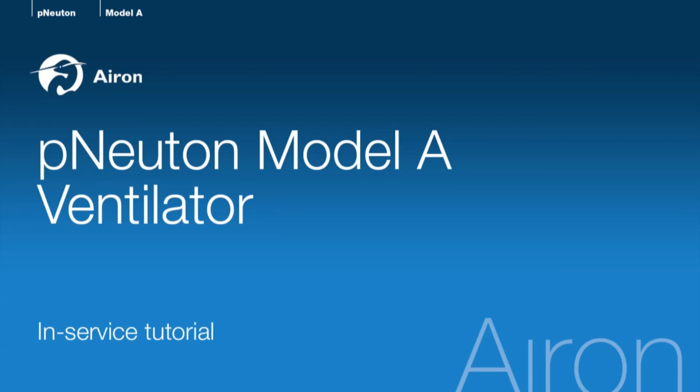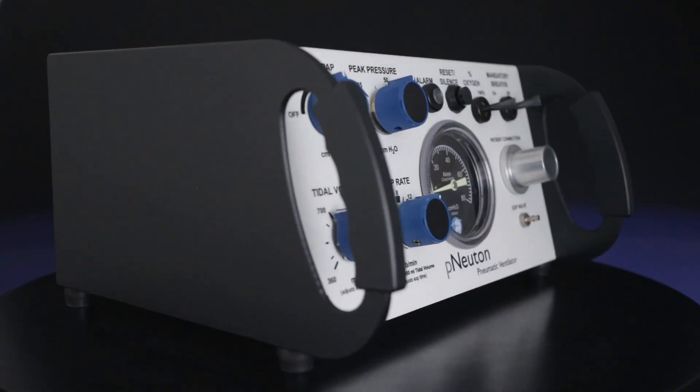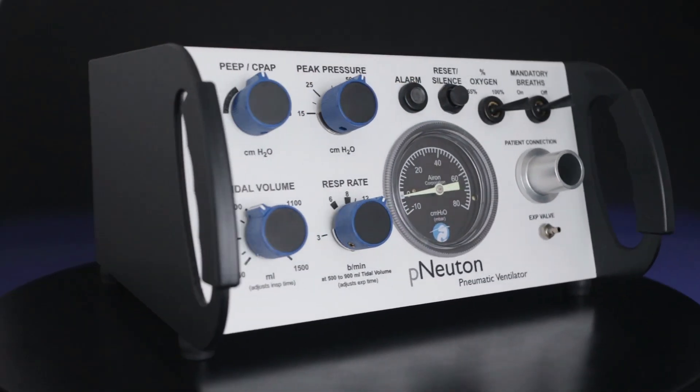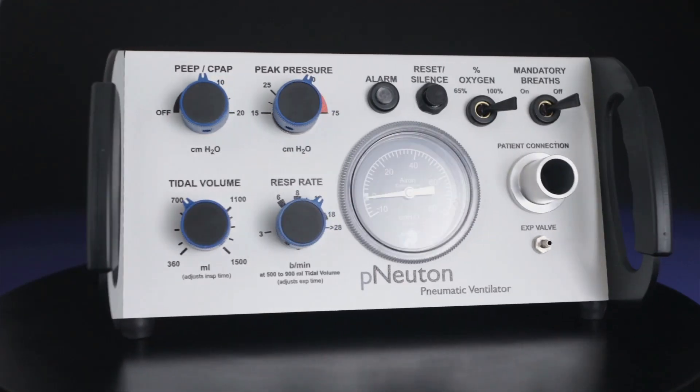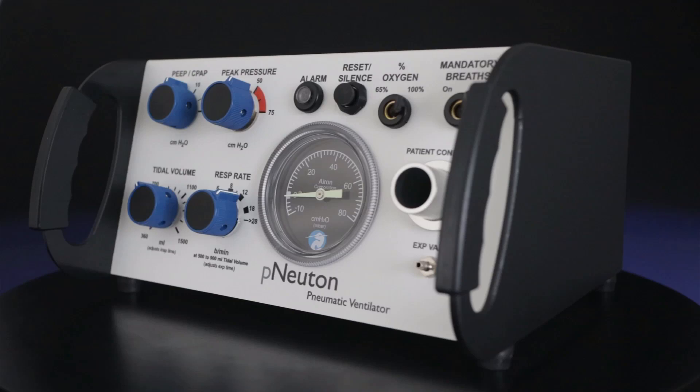Welcome to this in-service tutorial for Aeron Corporation's Newton Model A Ventilator. The Newton Model A is a small, lightweight pneumatic ventilator with built-in CPAP designed for use on pediatric to adult patients 50 pounds or 23 kilograms and greater.